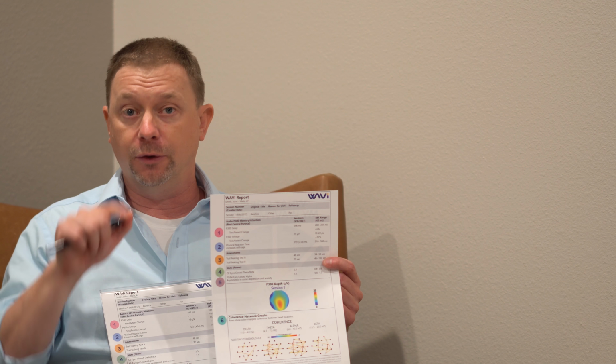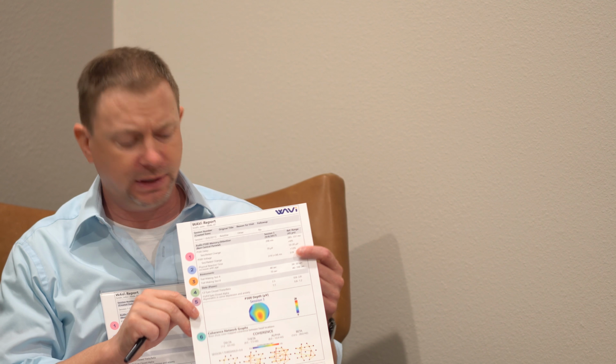The P300 is perfect for that because the P300 measures those regular noises of beep, beep, beep, beep, and then the oddball beep, the higher sound. And that's pretty much what it sounds like when you're listening to it. So you'll be able to measure that and see if there's a delay in the processing time of that signal.